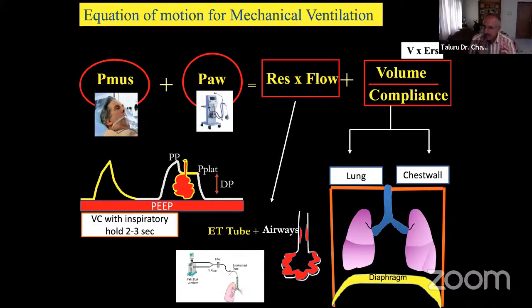And most of the lung and airway pathology has to be medically managed. Remember this, there is a very small scope for us to work with the ventilator and correct the medical cases. Whereas with the chest wall, if you decide that it is because of the chest wall, you can be a little more proactive in putting PEEP, accepting more plateau pressures and more driving pressures, and be aggressive with recruitment maneuvers. Am I clear? Any doubts in this?